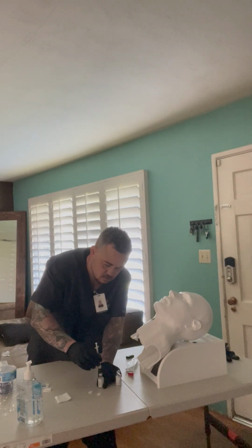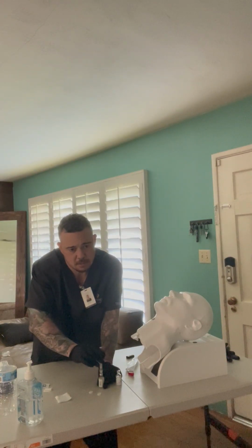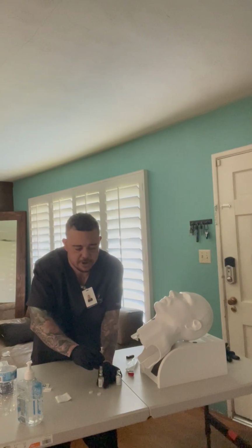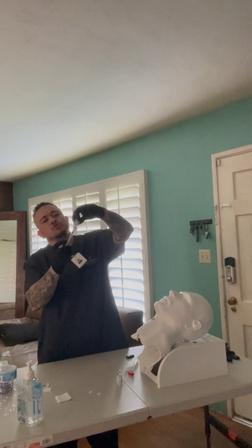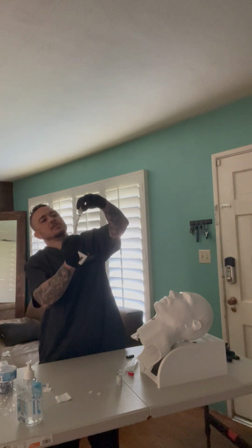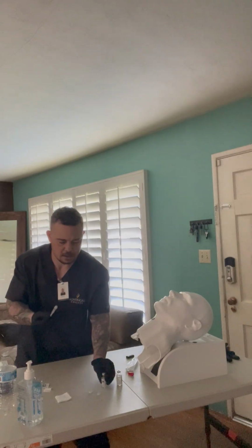I'm going to push this down and insert the air, and then I'm going to invert it. I'm going to invert this and draw up 4 units of regular insulin. I want to make sure there are no bubbles. 4 units here. So once I do that, I have the 4 units of regular insulin.